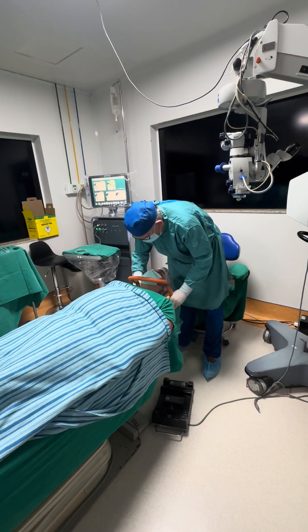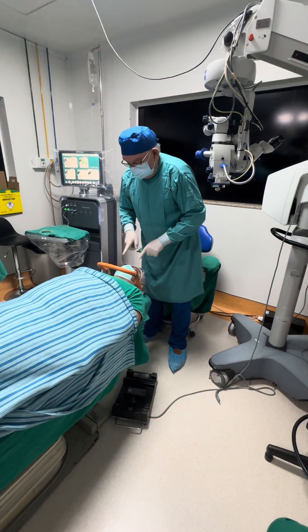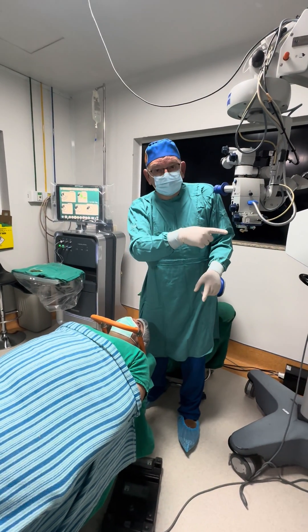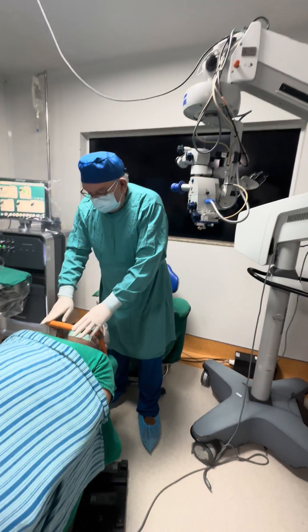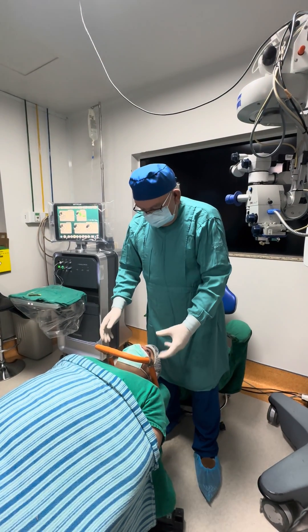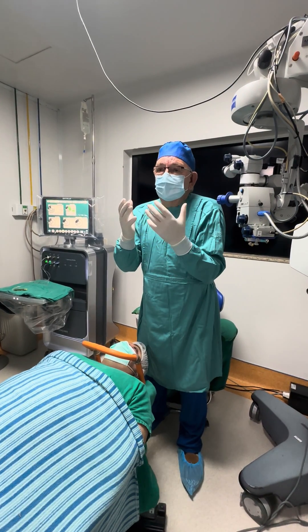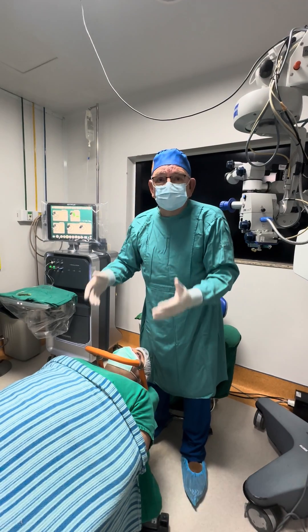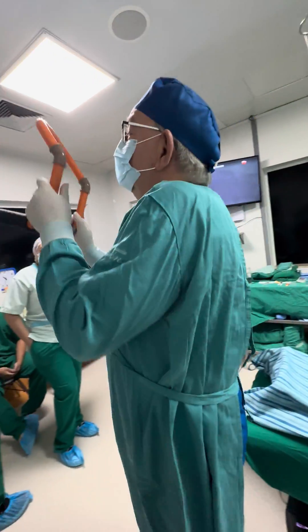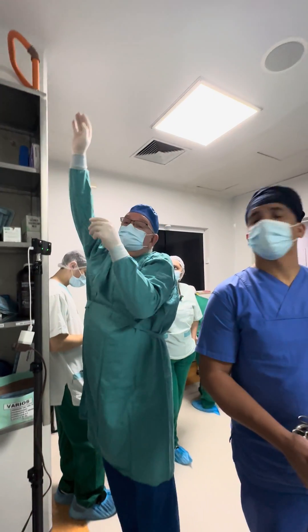So we put this here to avoid — we got some space here so the patient can breathe. The breathing air is being redirected down so that the belt doesn't go at the upper face and we don't have problems with that. It pushes the air down. You can design a device where you can connect air or oxygen, something that you can move. When you cover the patient, the patient breathes easily and doesn't feel claustrophobic or feel like having something inside. So we did this — this is a water pipe. That's how we survive in South America.